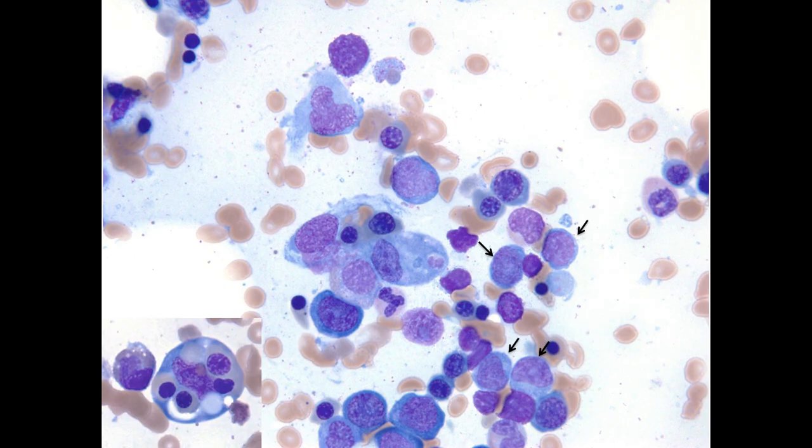He ultimately came to bone marrow aspiration and biopsy, which showed this. It's relatively easy to appreciate that he has marked hemophagocytosis. This macrophage is eating many of its neighbors, including at least 3 red cell precursors. Other cells are eating platelets, and in other fields you could see mature red cells being eaten. But it was relatively easy, actually, to overlook the fact that he also had a large number of these abnormal appearing lymphoid cells highlighted here by the arrow.